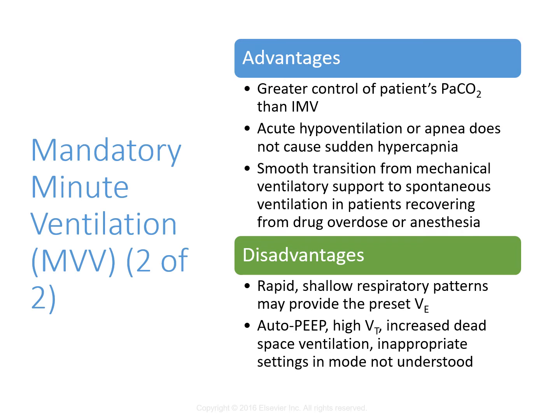Other problems: you could develop auto-PEEP if you have really high tidal volumes, right? If you have an inappropriate set upper pressure limit, that could really impact it. You could see an increase in dead space ventilation. We talked about that, if you have inappropriate understanding or if you misapply it as well. So you need to be aware of that whole dead space to tidal volume range.